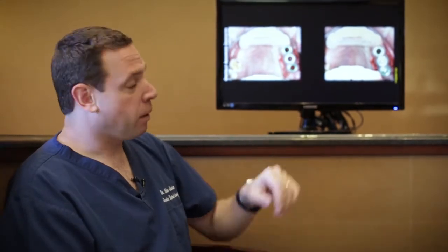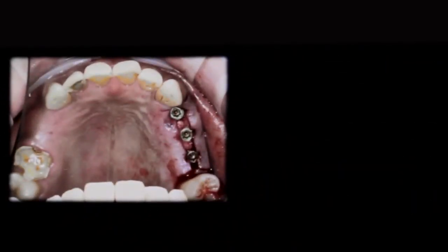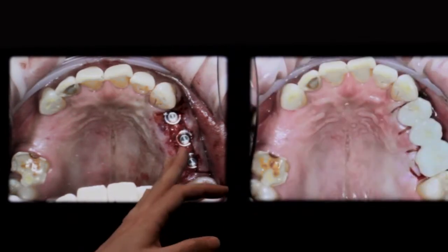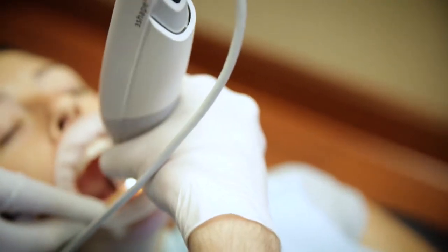In this case, the implants at this point are now being delivered. The final implant is going in through the surgical guide. We have the final implant placement. On top of the final implant placement, we have our restorative components and then the provisional bridge that was manufactured prior to the surgery. And so the patient came in with no teeth and left with 3 incredibly strong teeth.